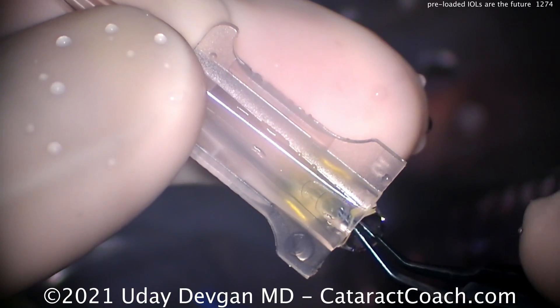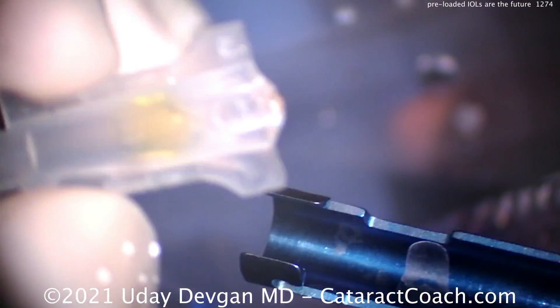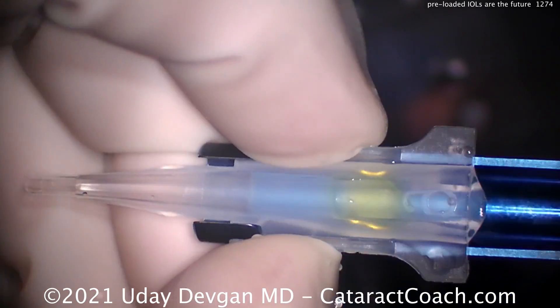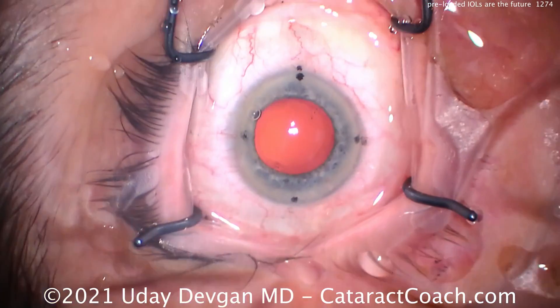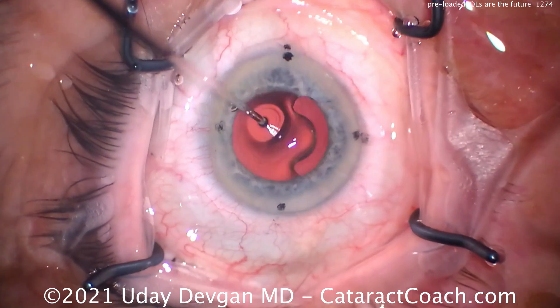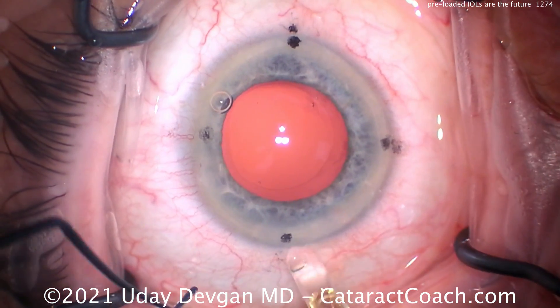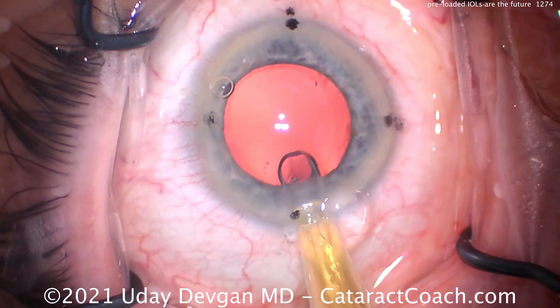Let's talk about the names. This lens is CNA0T0. My guesses: C stands for Clarion, N is natural — probably the yellow tint — A means it's acrylic. Then 0T0: the first zero means there's no depth of focus, add, or anything else, and T0 means it's non-toric. T3, T4, or T5 would be toric variants.